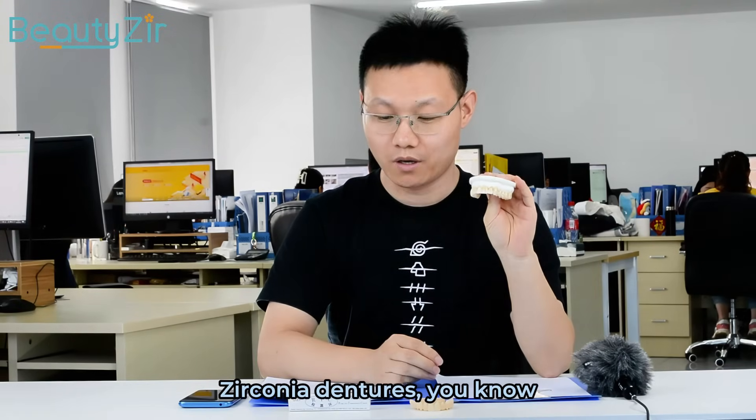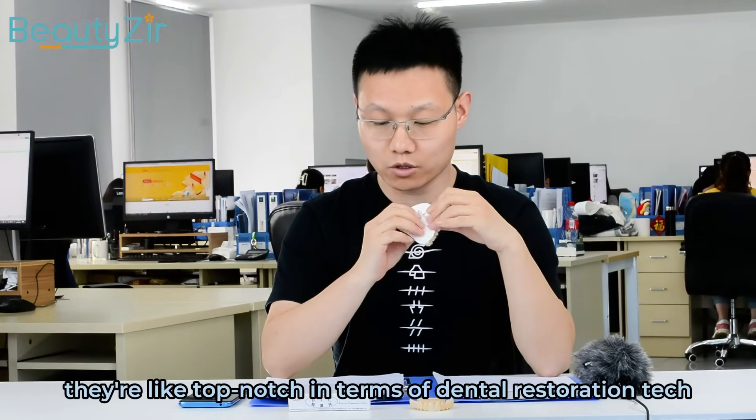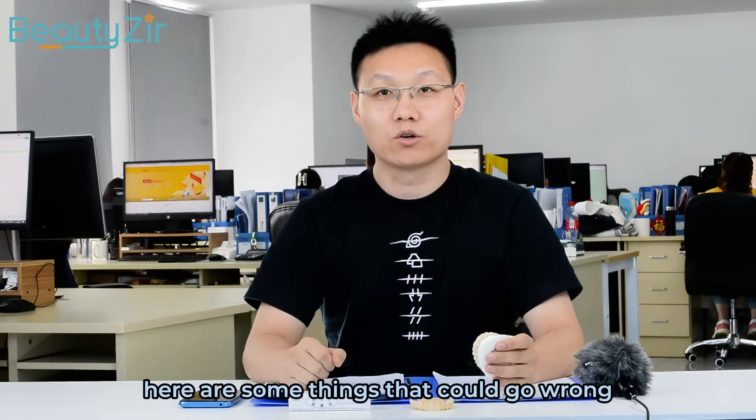Zirconia dentures are like top tech in terms of dental restoration technology, but even pros can mess up during the whole manufacturing process. Here are some things that could go wrong.